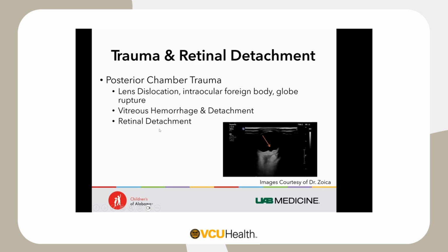And the whole appeal of optic ultrasound is that you're able to catch these findings sooner, able to get ophthalmology involved sooner, because I'm sure a lot of us have found that ophthalmology, while they're easy to come in, they're not always available as soon as we might like them.